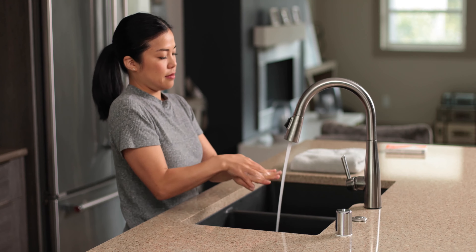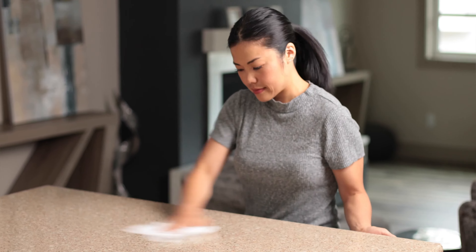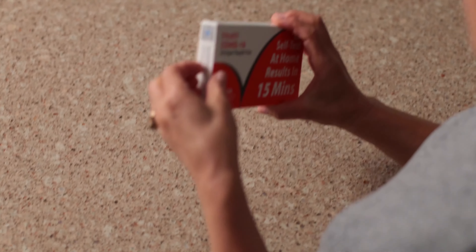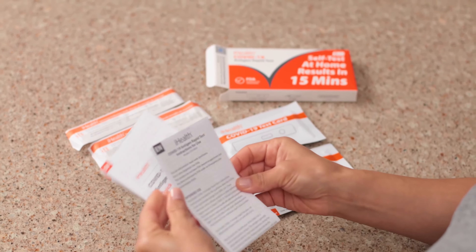For starters, thoroughly wash your hands with soap and water. We also need a clean, flat testing area. Take a moment to disinfect some counter or tabletop space. Once it's dry, lay out the following items from your kit, but don't remove them from their individual packaging just yet.